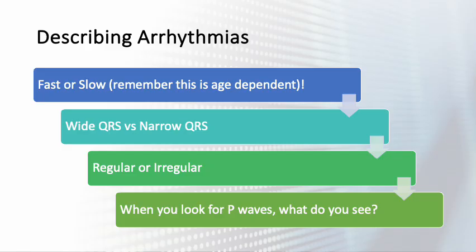So what I teach people when they're thinking about how to talk about arrhythmias, because so much of cardiology and electrophysiology is about the lexicon that we use, is how to describe arrhythmias, because pictures are really worth 1,000 words when it comes to heart rhythm assessment and management.